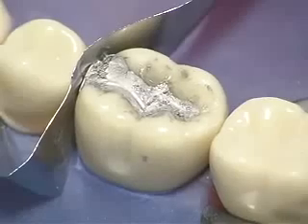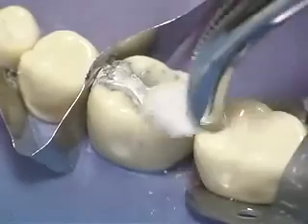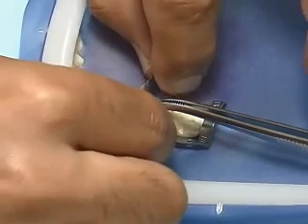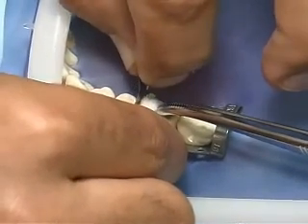Once occlusal anatomy is complete, use a moist cotton pellet to smooth the occlusal surface of the amalgam. Carefully remove the matrix band by rotating it and sliding it out of place.